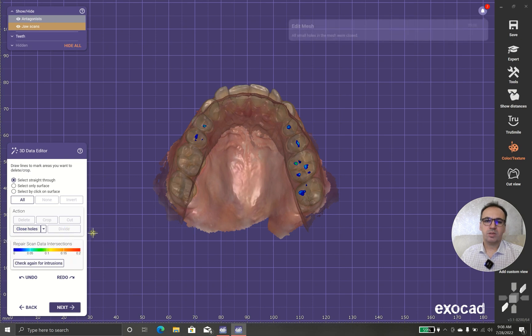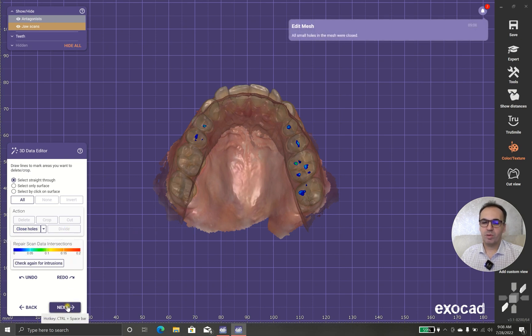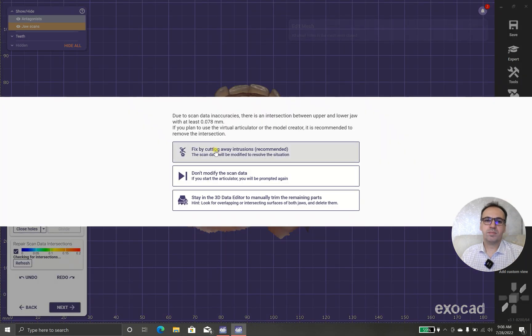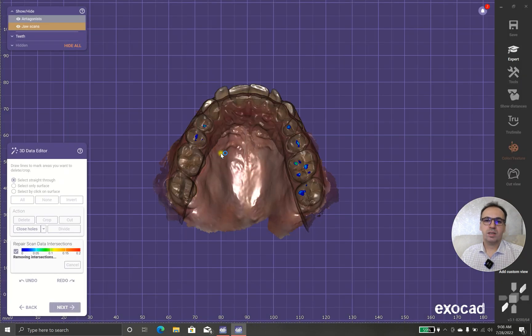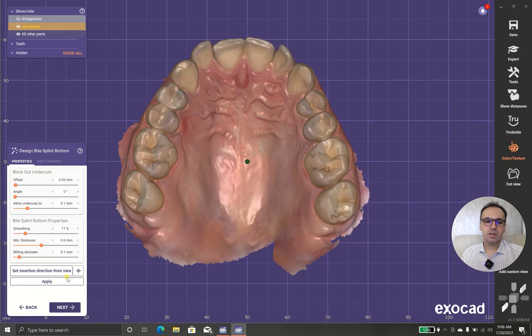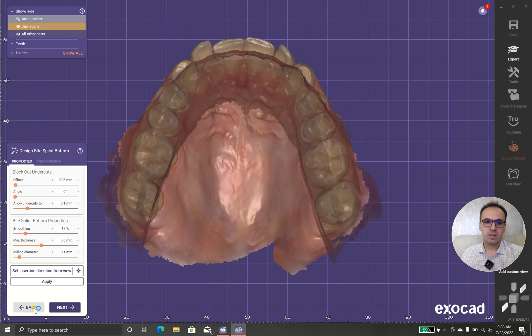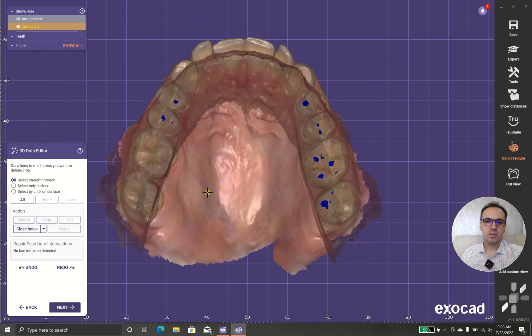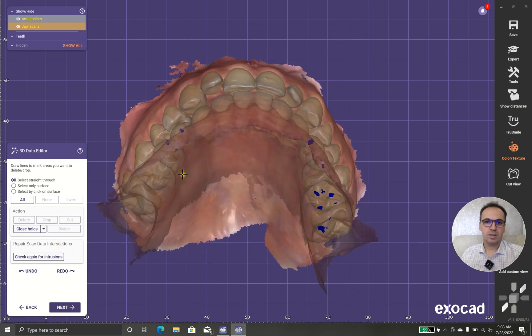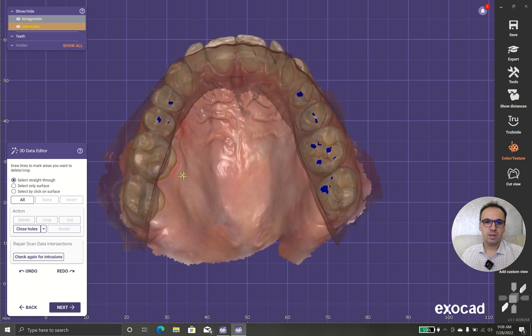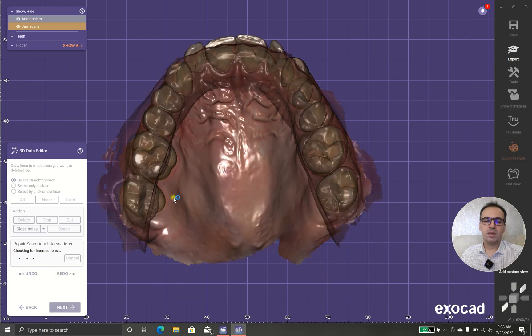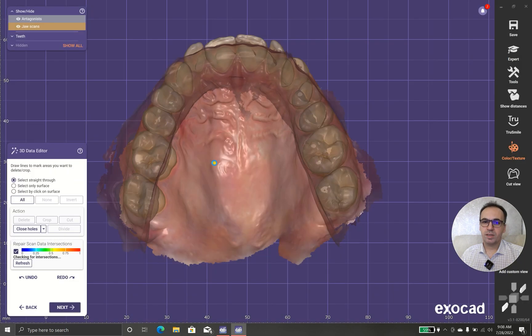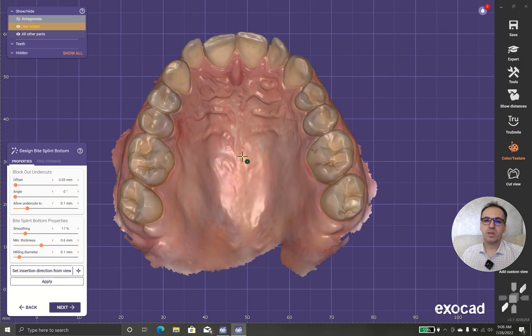We should close holes. Maybe in the scan we have some small holes, so it's better to close them. You can do this or okay. I prefer not to touch, don't modify scan, choose this one.